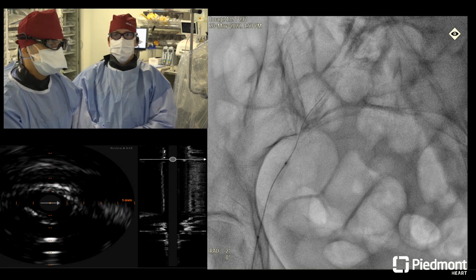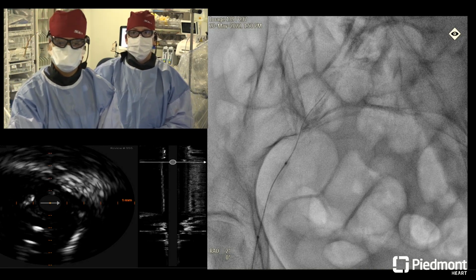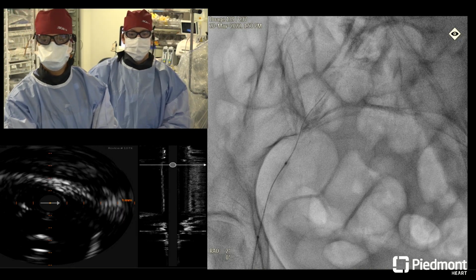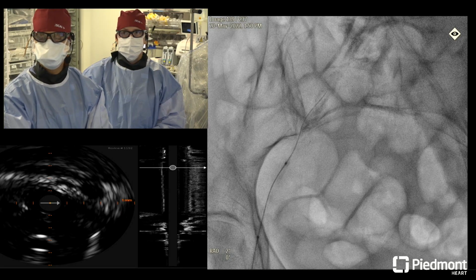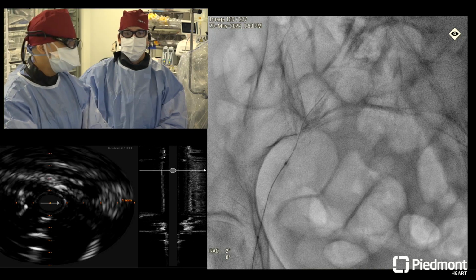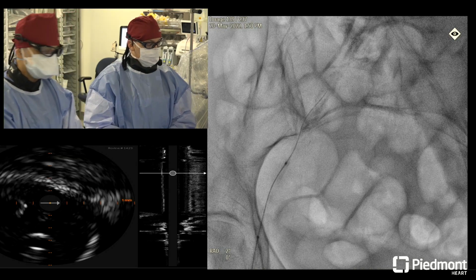I was a little bit worried about it. We went through that exact same discussion, but unfortunately, both by ultrasound and at the time of the previous attempt, the caliber of the radial artery would not have taken the 6 French sheath, and of course the R2P, the smallest is 6 French, so we kind of discarded that option. So in fact, the left radial sheath is a 5/6 slender.